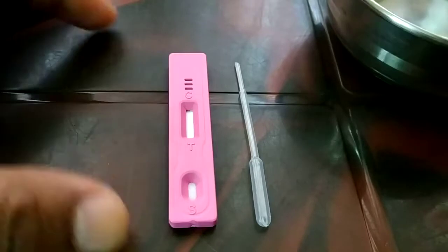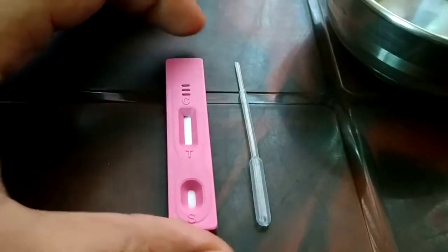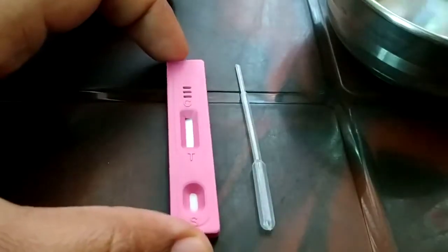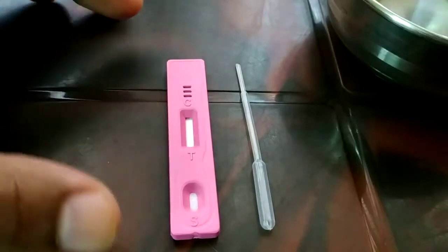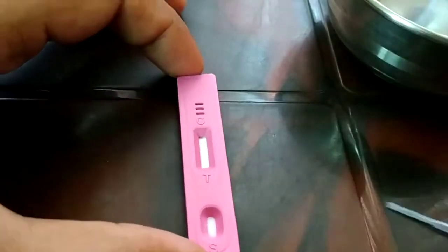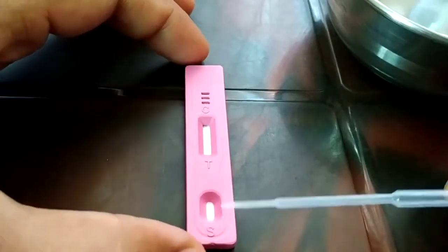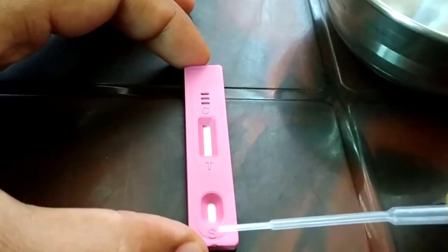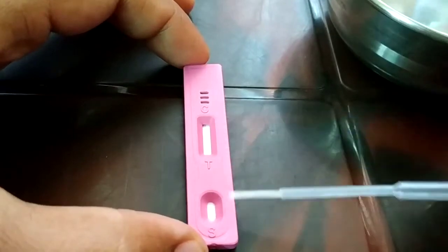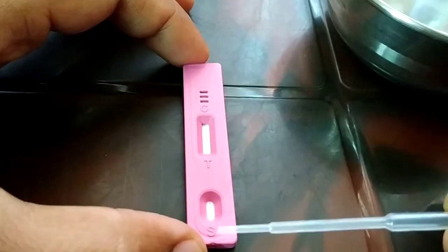When you purchase a device to do the pregnancy test, you'll be getting two devices. On this device you'll see the letters S, T, and C — three different letters.